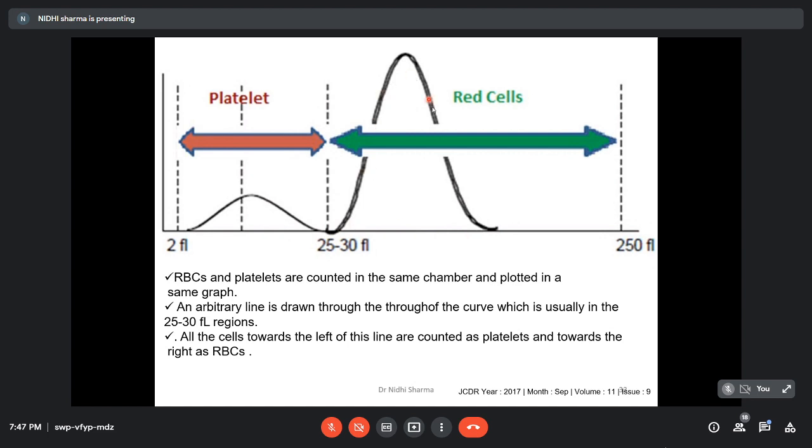You look at the number of peaks, look at your lower discriminator, whether it is set right. This is a flexible discriminator, and if you run many samples in your lab and you feel it is a little more shifted towards the left, and that suits you better, that flexibility the analyzer allows you.